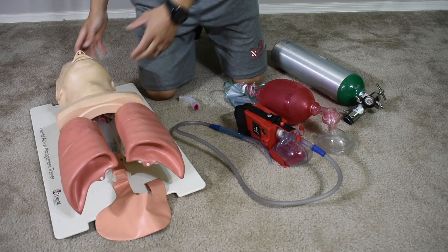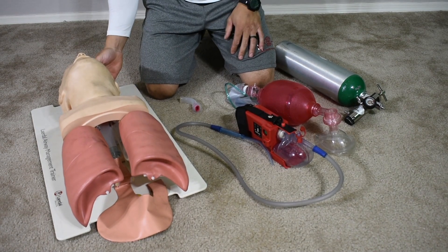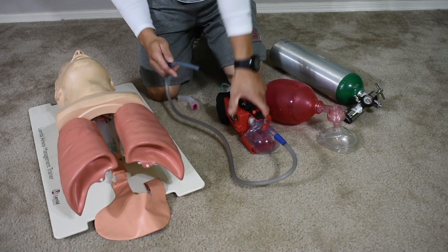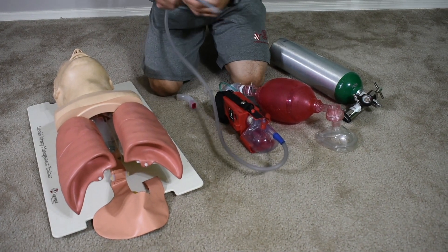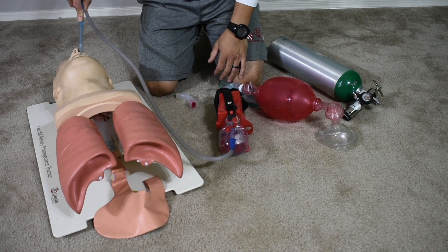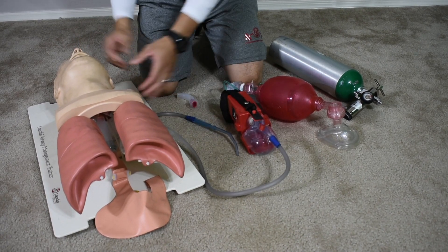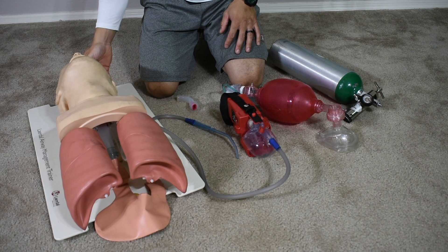I'm going to open the airway with a head-tilt chin lift. The mouth is full of secretions and vomitus. I'm going to gather my suction unit, turn it on, and test it on my glove hand. I'll insert it and suction in a circular motion on the way out for no more than 15 seconds. Reopen the airway — the mouth and oral pharynx are clear.